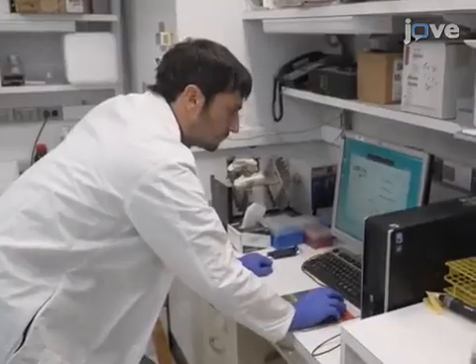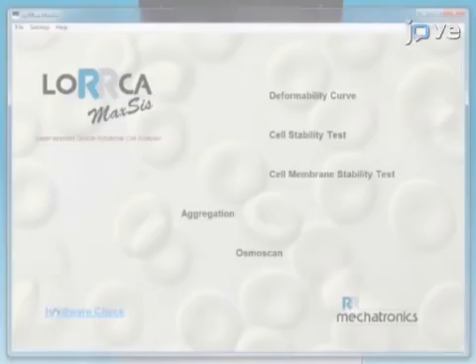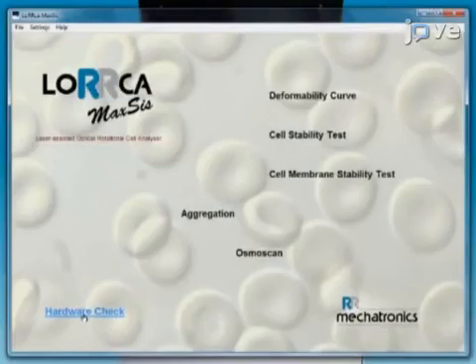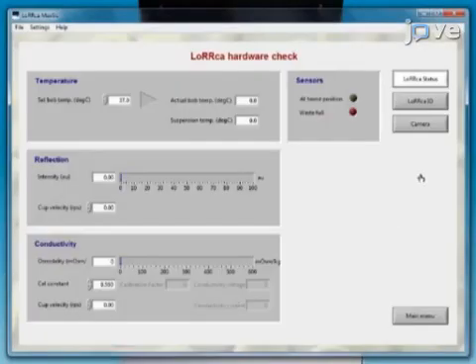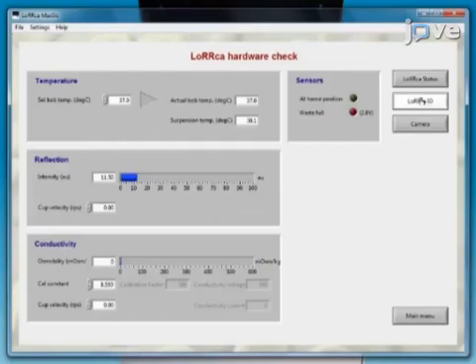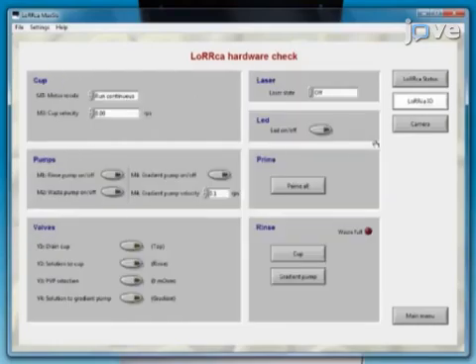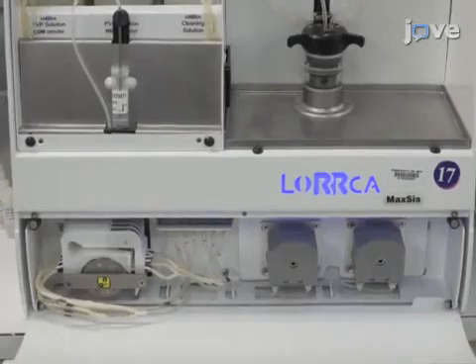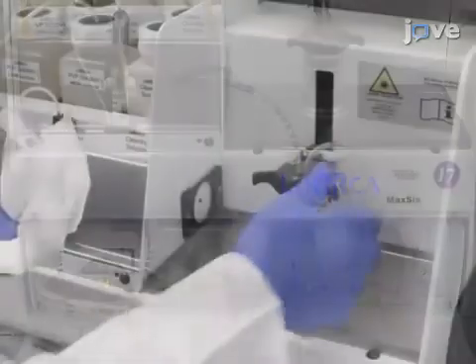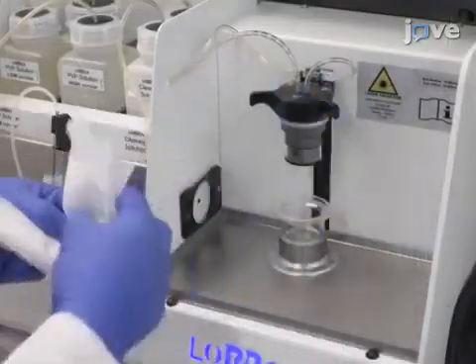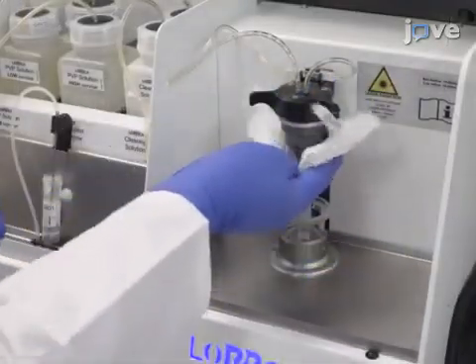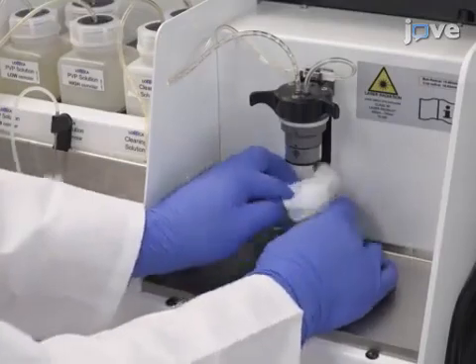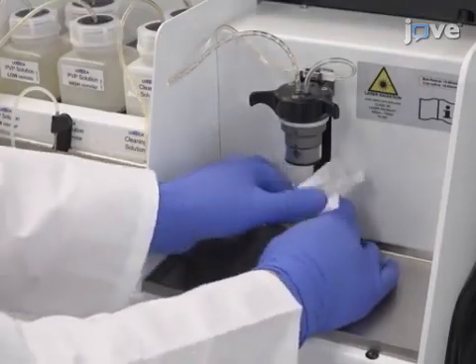Launch the software and prime the machine by selecting Hardware Check and then Instrument I.O. Allow the instrument to complete the priming cycle. Once the cycle is complete, lift the bob out of the cup and completely dry the bob and the cup with a low-lint cleaning tissue.